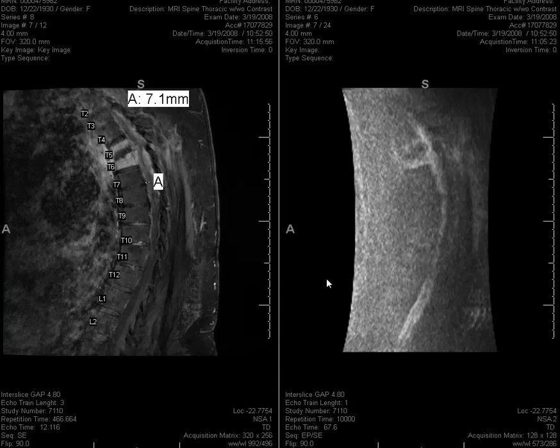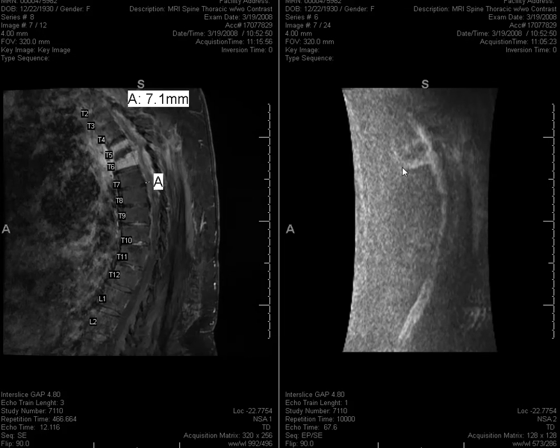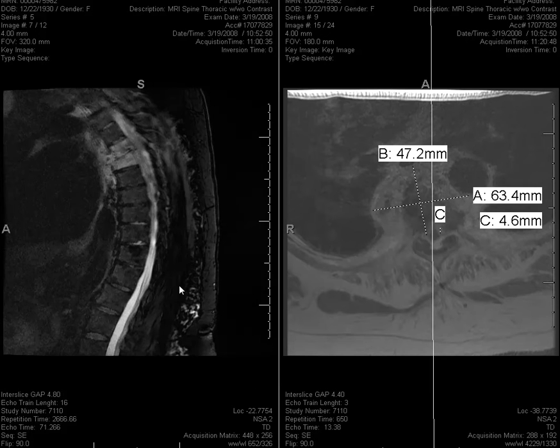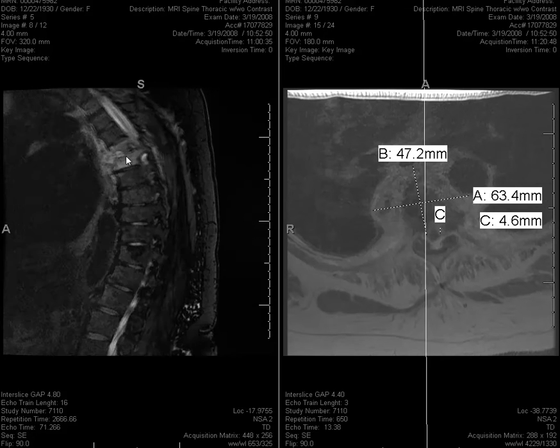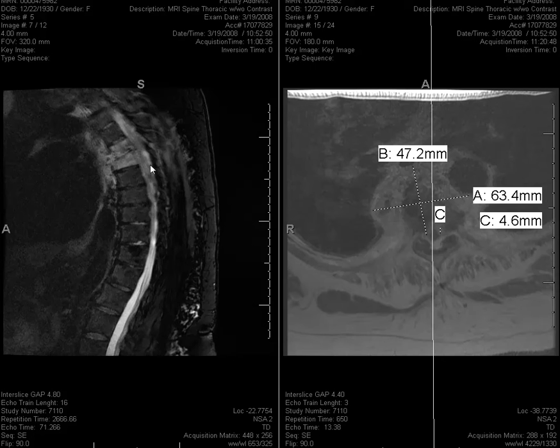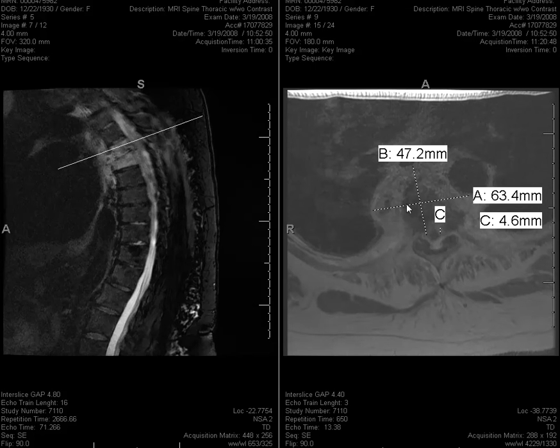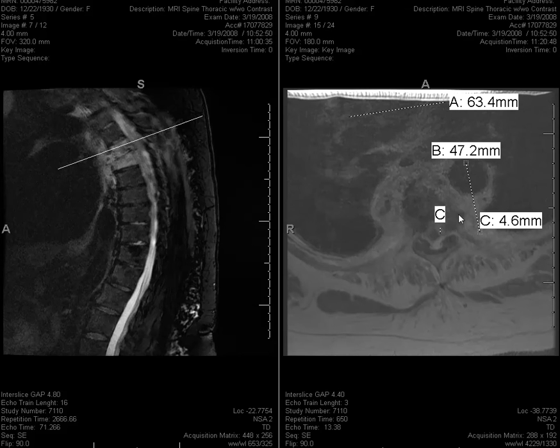This is a 77-year-old lady with questionable discitis. You can see the contrast enhancement is diffuse, there's vertebral endplate destruction, and there's epidural contrast enhancement. On the T2 images, the signal is bright — T2 hyperintense. If it's dark, infection is very unlikely. So far this is very classical discitis and osteomyelitis with epidural infection and contrast enhancement in the perispinal soft tissue. Maybe part of it is abscess.